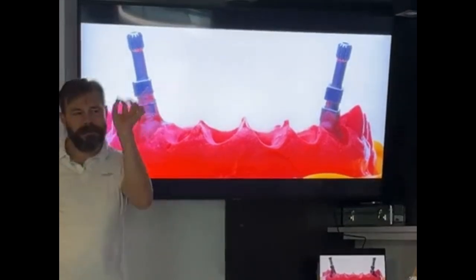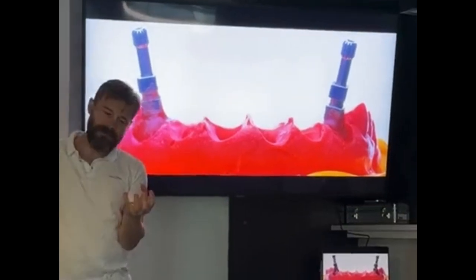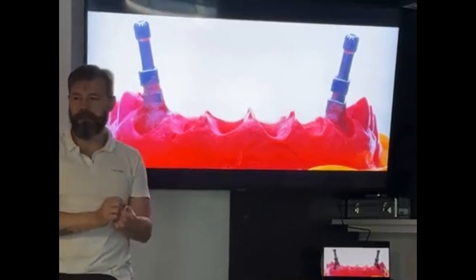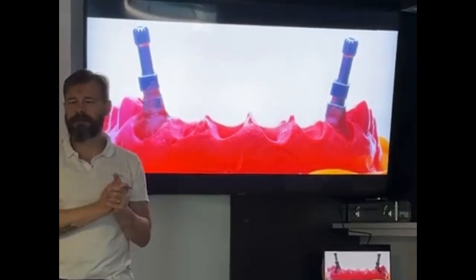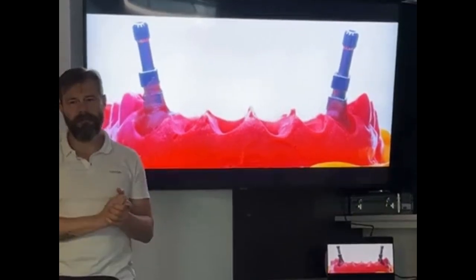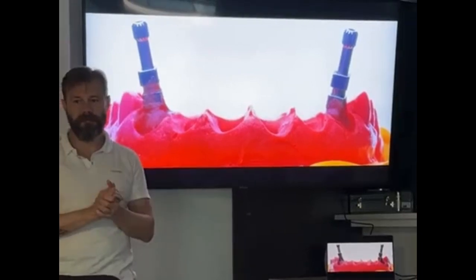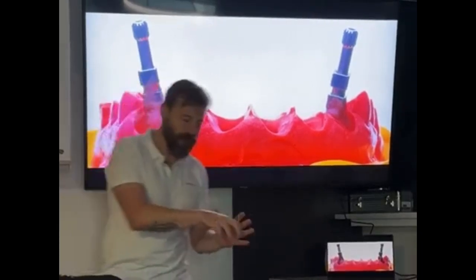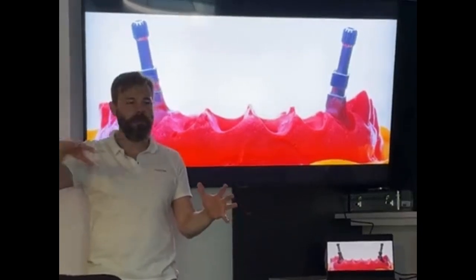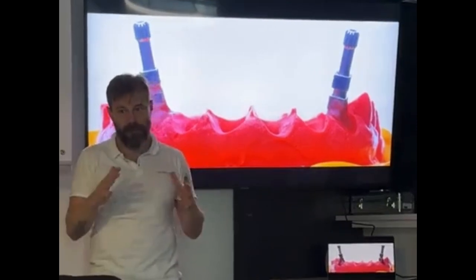Remember, last day I showed one very fast case where I have a similar cast. I took the provisional, you have the gap, and you fill the gap, right? How long does it take you to modify one crown? Maybe 20 minutes, not more than that. Four crowns is 40, 45 minutes. Once again, if you do everything with the provisionals taken from the mouth, it's almost 45 minutes that the tissue is alone, and it is going to collapse.